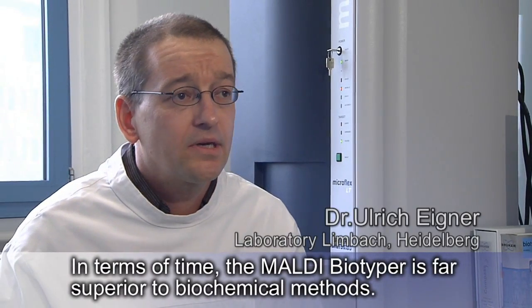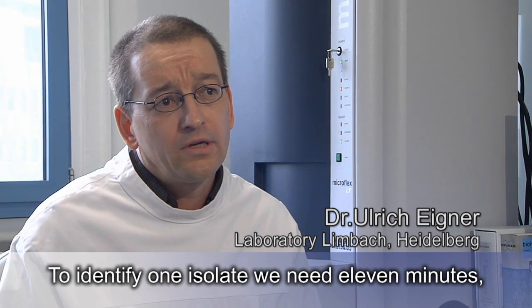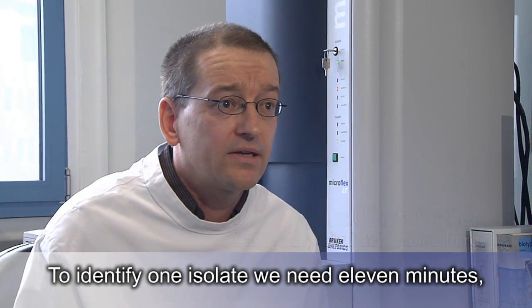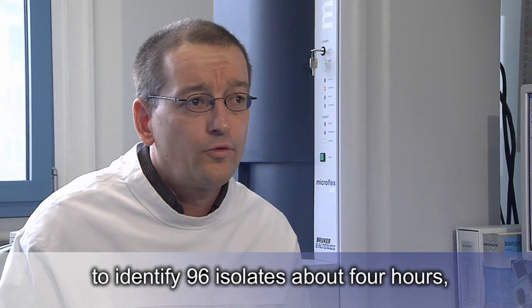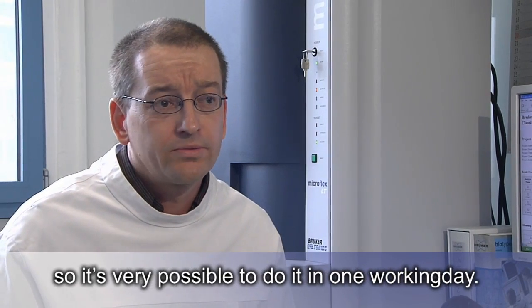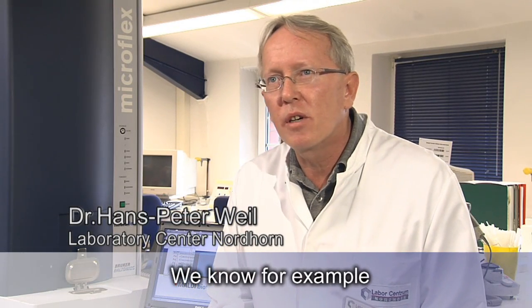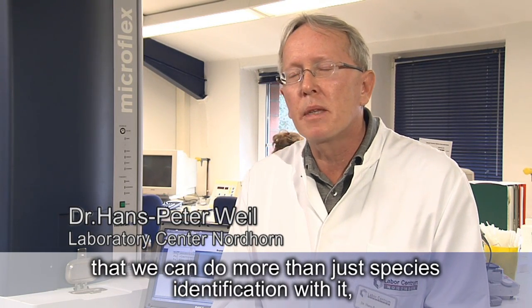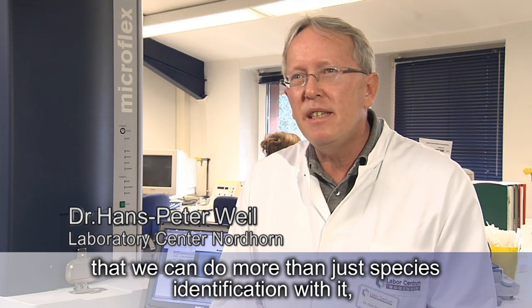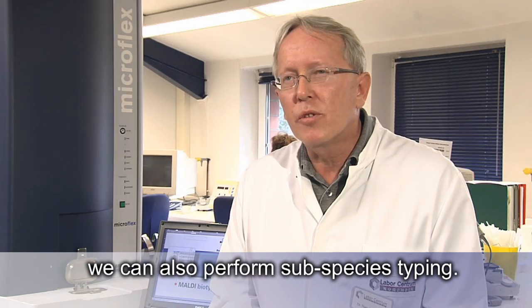In terms of time, the Maldi Biotyper is far superior to biochemical methods. To identify one isolate, we need 11 minutes. To identify 96 isolates, about 4 hours. So it's very possible to do it in one working day. We know, for example, that we can do more than just species identification with it. We can also perform subspecies typing.